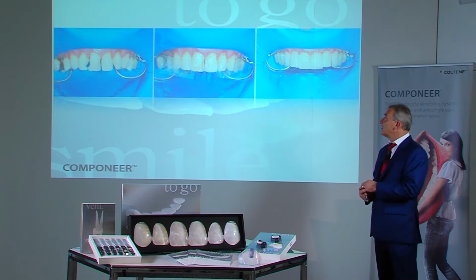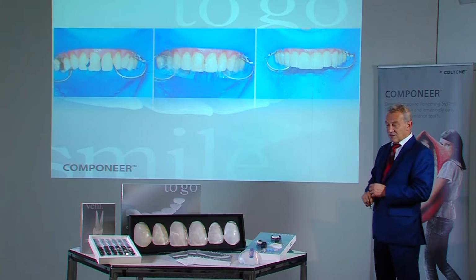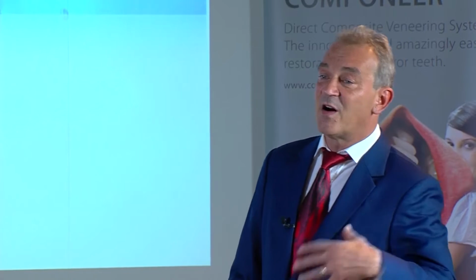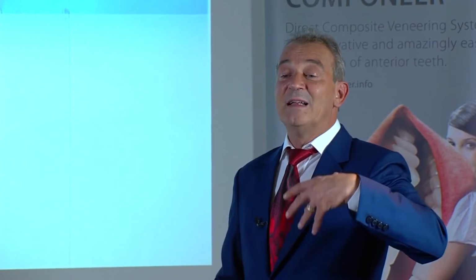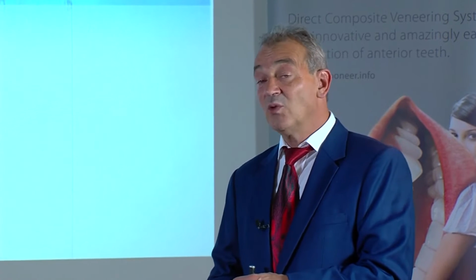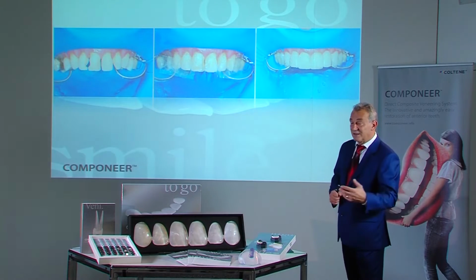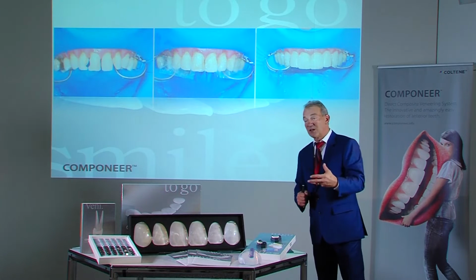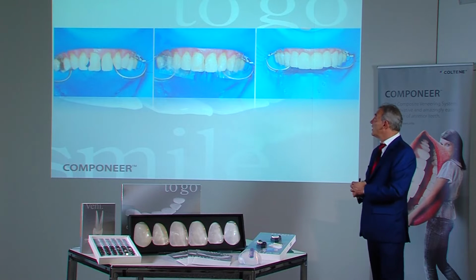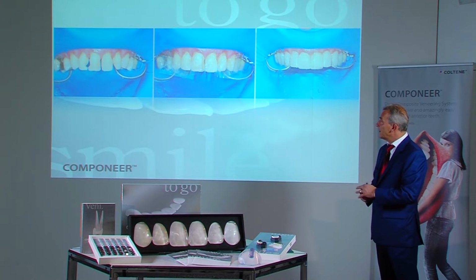The old restorations were removed, with the exception of this abutment on the central incisor. If the old restorations are fine in terms of color shade, if there is no marginal discoloration, and if secondary caries is not suspected anywhere, then they can be retained. Of course, they must also be pre-treated by sandblasting, silicizing and bonding. But the repair of old restorations is something we will deal with in Chapter 4.